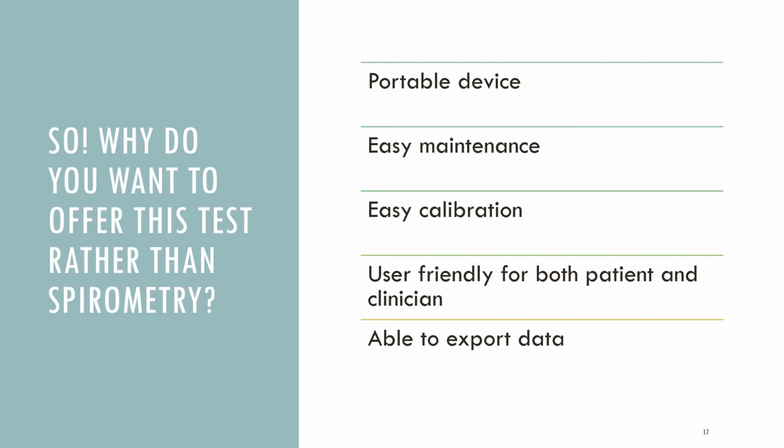Also, it's very user-friendly for both the patient and the clinician. What that means is it doesn't take much effort from the patient to get a valid test. Versus spirometry, where you have to coach the patient and make sure the patient does everything correctly. And if you get a patient who is young, or a patient who's really old, sometimes spirometry can be quite difficult with that population. But with this device, it's rather easy, and the whole test takes less than a minute.